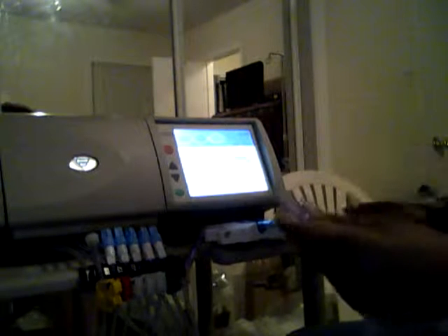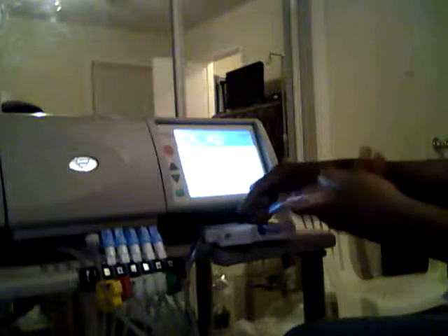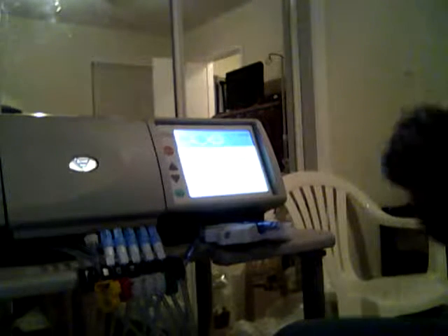And just twist the top off of that. Twist the top off of the solution line, or the patient line. And voila. You have 2 extra extensions. And that's when I do my pause if I get up in the middle of the night to do something. So just stick the new end into the organizer and that is it. Now it's saying connect solution lines, place bag on heater tray, and connect the drain line.